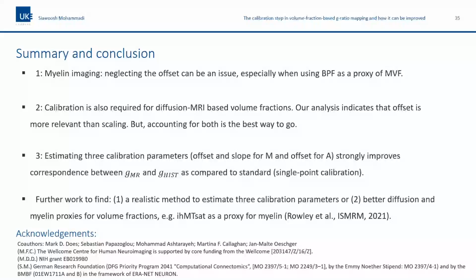Those would be my two comments. But we often need ratios in MRI to get quantitative results, because the imaging is in arbitrary units. So when you're doing relaxation metrics, in a way it is also a ratio that you're doing.